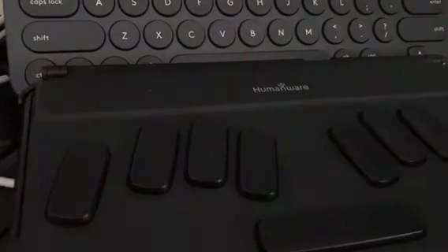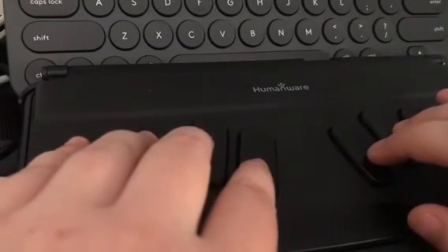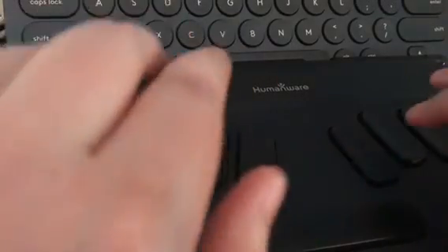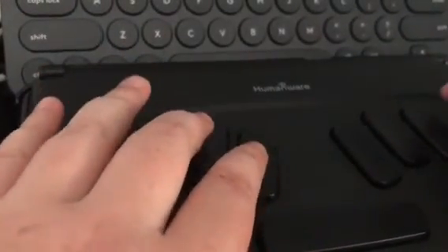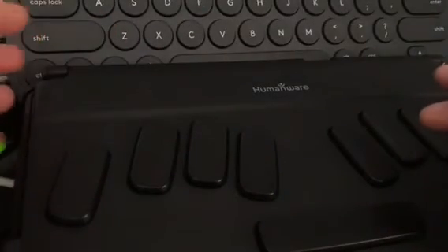I'm going to press Enter with Q to go to the quick menu, and then press B to go to Bluetooth. Yep, Bluetooth - here we go. I'm going to press Enter.